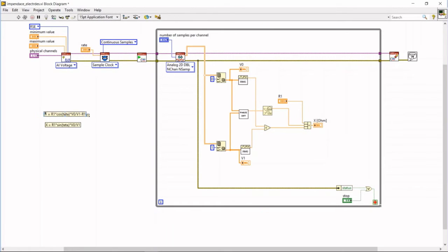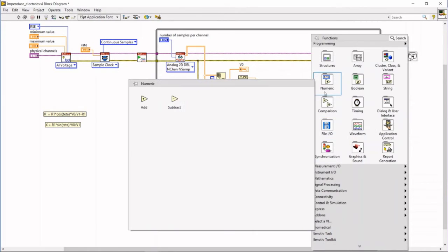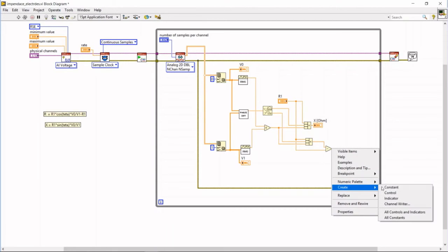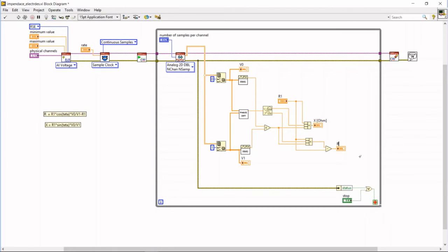and the R is equal to also compound arithmetics. We have R1 cosine of the phase difference and V0 divided by V1. We also have to subtract the R1, so we are going to use subtract function that we're going to connect to R1. So as the output, we get R in ohm. Okay.